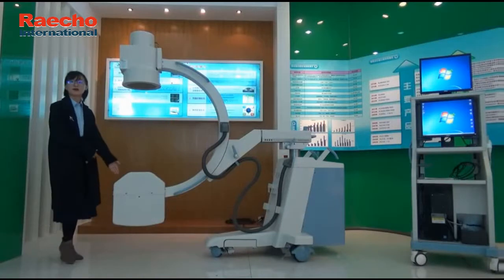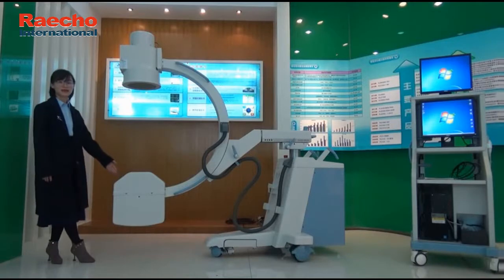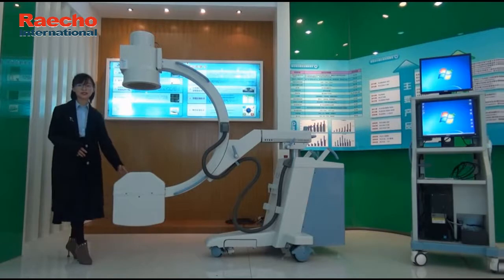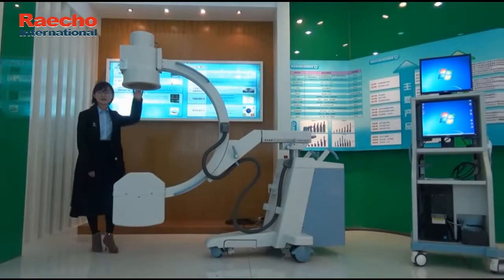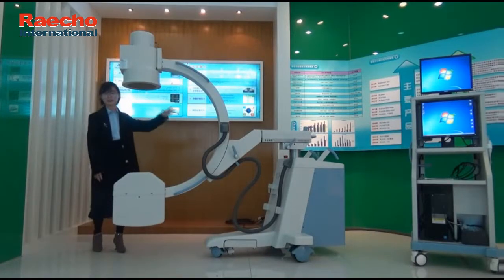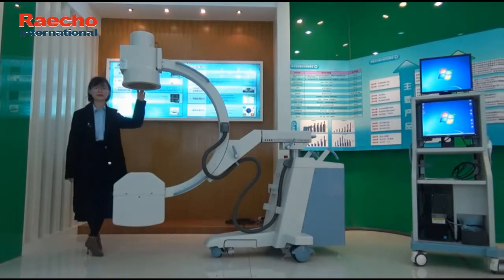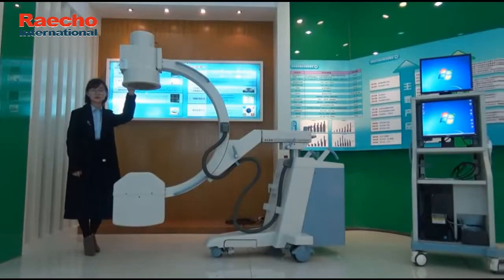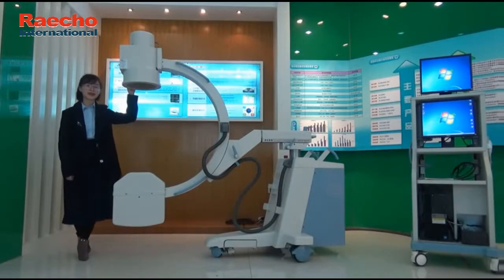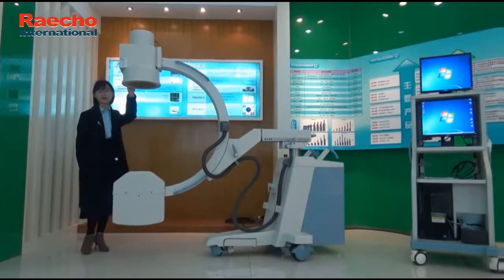Our high-frequency generator design has a maximum output power of 5kW and an inverter frequency of 40kHz, providing high quality X-ray penetration. The C-arm opening is 740mm and the C-arm depth is 640mm. It can give doctors a suitable operational space. The machine is equipped with a Toshiba 9-inch image intensifier with 3 views and a new 1,000,000 pixel CCD camera, ensuring excellent image quality.